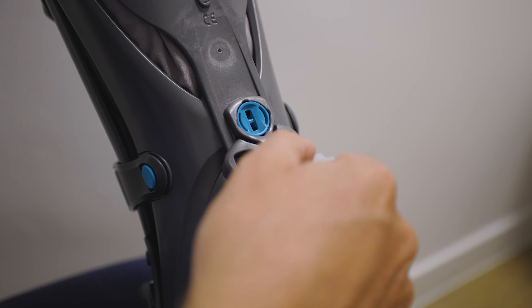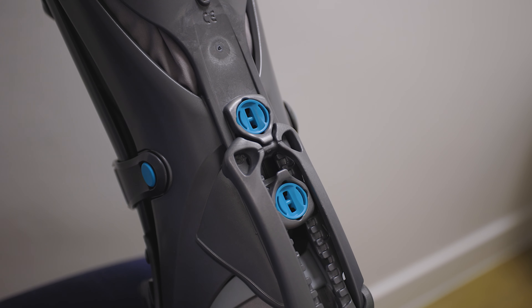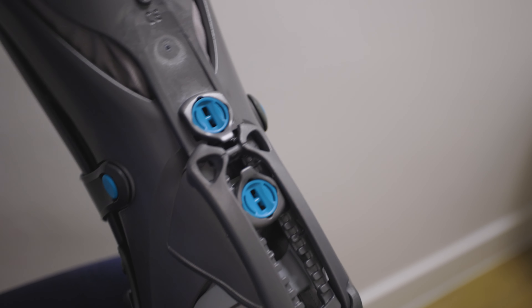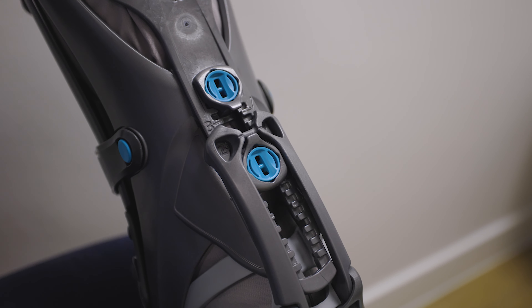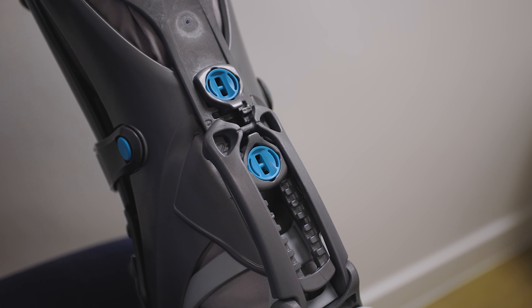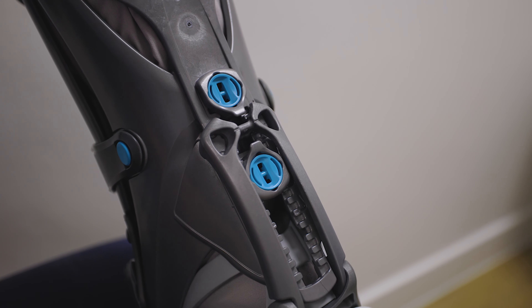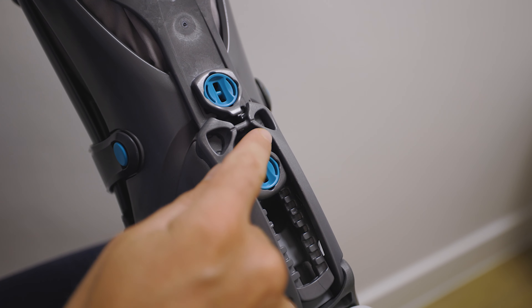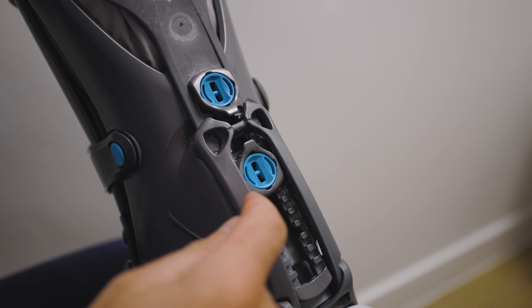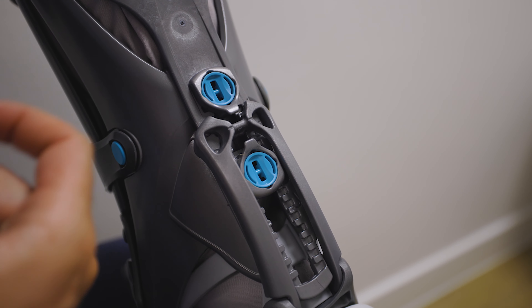If we just do two teeth — one, two — and then lock it in. What you can see now is that the foot is actually allowed to move. It's still in that plantar flexed downward position, but it gives you some mobility. As you progress through the eight or nine weeks that you're going to use the boot, you're going to end up with this button going down to zero. At that point, you'll be able to go into your shoe, and we would recommend that you use a heel raise for that.